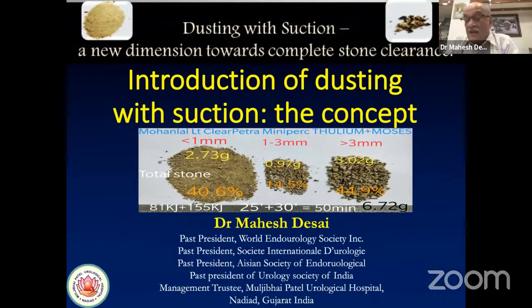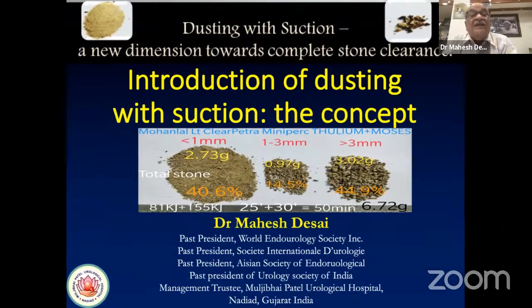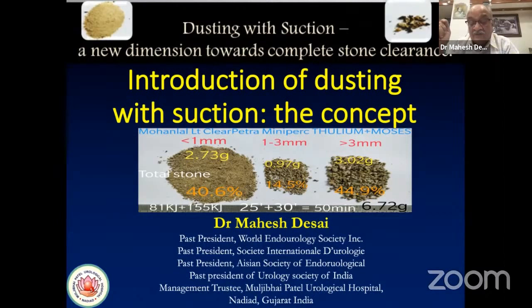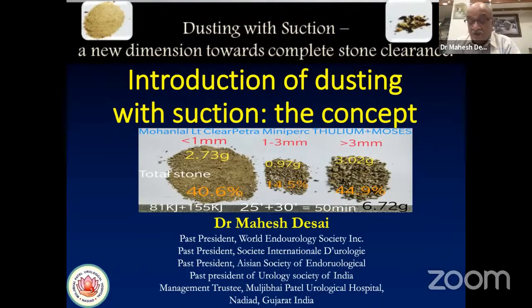Well, for many, many years we've been trying to clear the stone. I must congratulate the industry for innovating the technology which is helping us. Today, I foresee two important aspects as the future of stone management: the energy for disintegration and total stone clearance at the same time. In 2019 we had good development of energy like shock pulse, Trilogy, Moses laser, and thulium. For total stone clearance, there is an innovation in suction: powerful tube suction in shock pulse and Trilogy, and nephroscope sheath suction in PCNL, as well as flexible ureteroscopy.